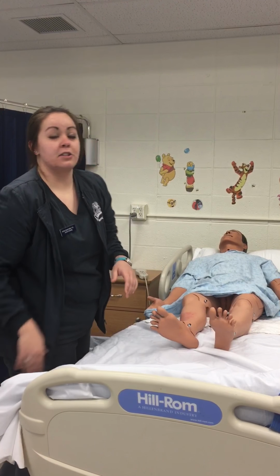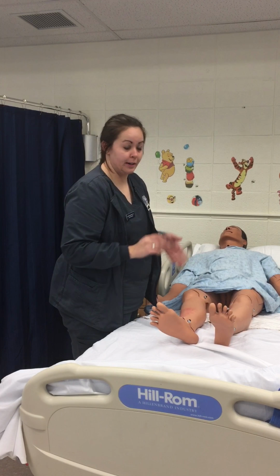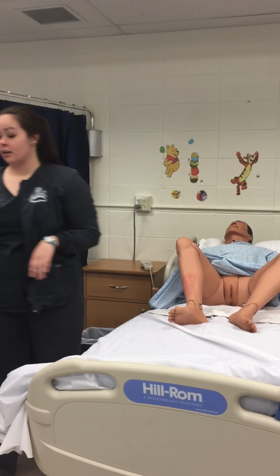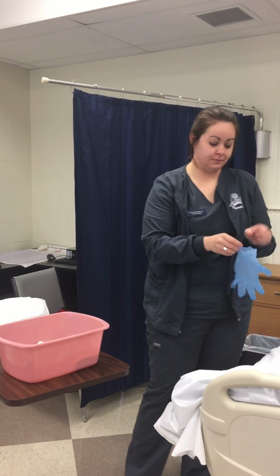And assist my patient if they require my assistance to get into the appropriate position for the procedure, which would be a frog-like stance. I would then don my non-sterile gloves.